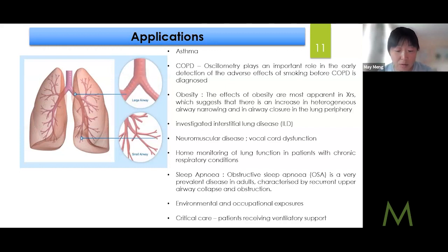So even if it's used together with spirometry, it might be used as the first device, but to confirm the diagnostic, then you need other measures. But it gives you a way to compare the cost, and maybe when you go to other markets, you can use that data to show the cost effectiveness. That's my comment. Thank you. Yeah, thank you.